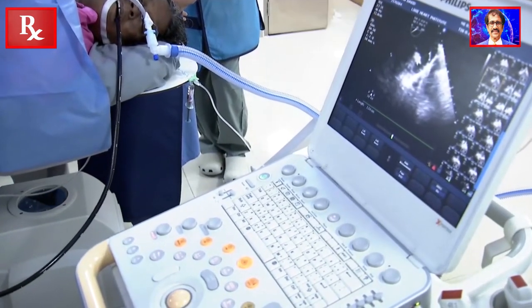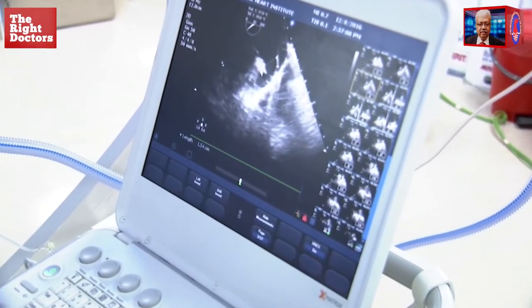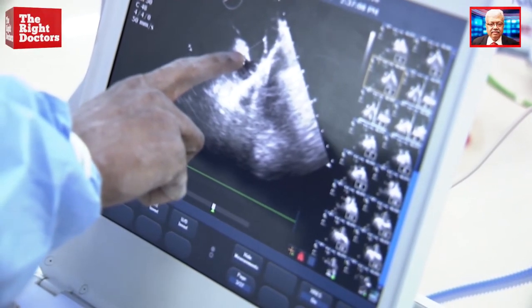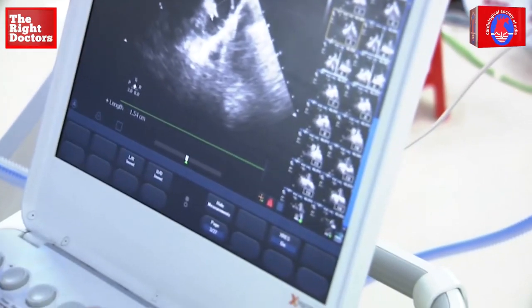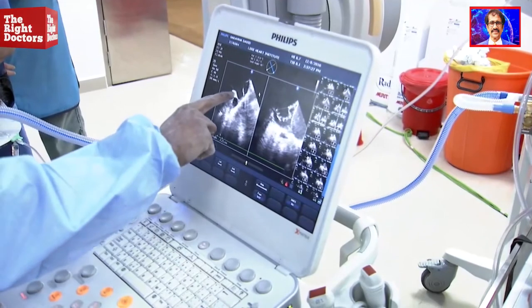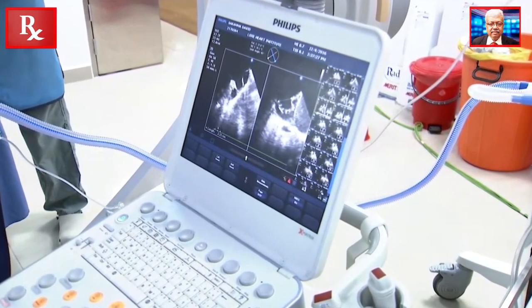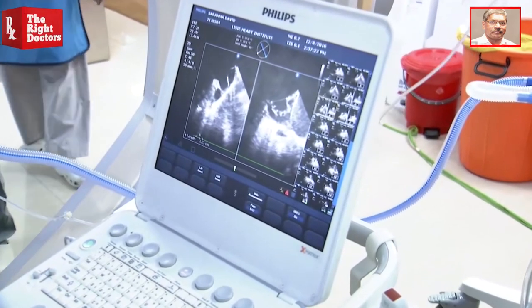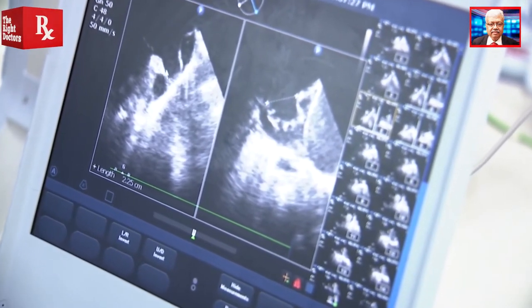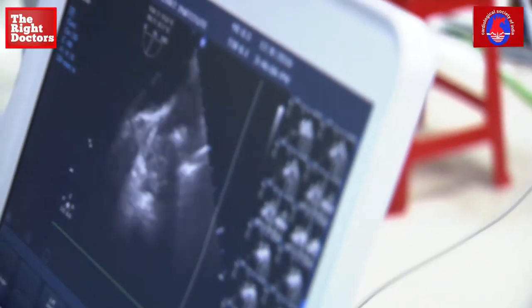It shows exactly where you see the circumflex artery — there's a round circle over there. Echo image — can you show? We are not seeing the image now — now can you see? The focus is going away. Is it towards the 5 o'clock position? No, no — it's at the 9 o'clock position. Can someone point it out? Show us exactly where it is — can you see the arrow? Center the image. That's right — where his finger is. That's the circumflex artery.